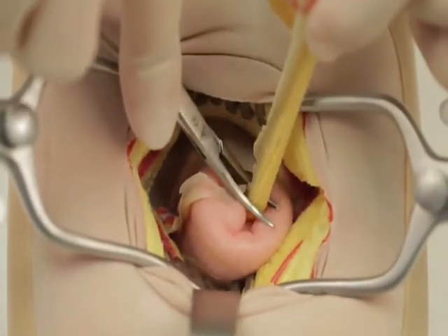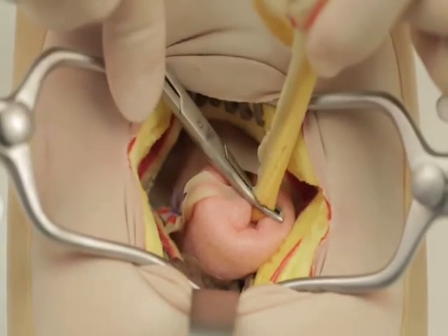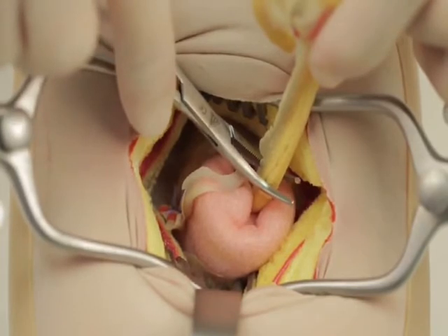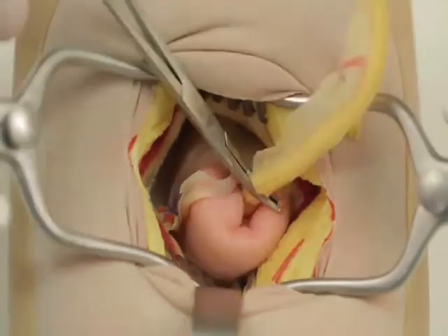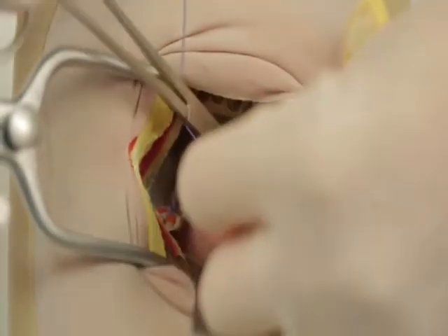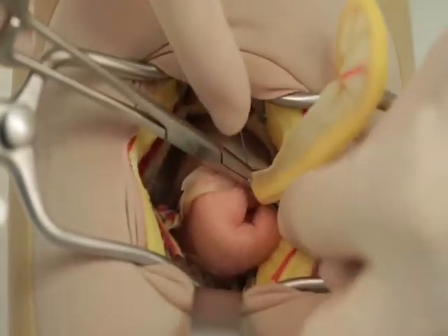Crush the appendix base with a haemostat and replace it distal to the crushed segment. Double ligate the crushed segment with 2-0 Vicryl.